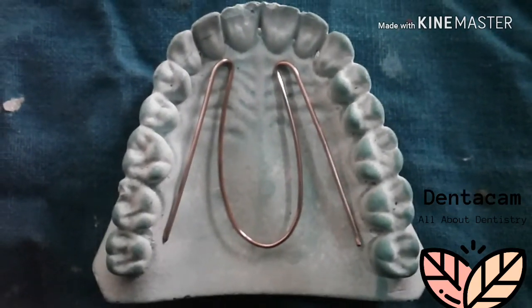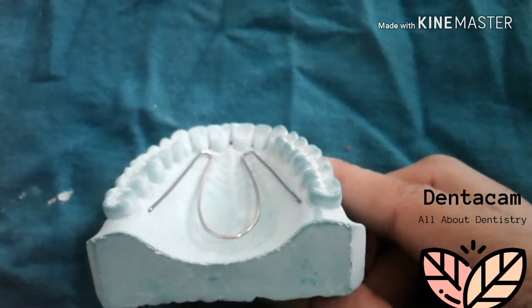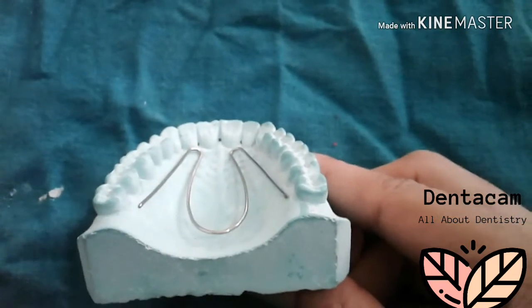Now see, as we gave the bend at an angle to the retentive arm, this makes the easy adaptation of the coffin spring over the cast.